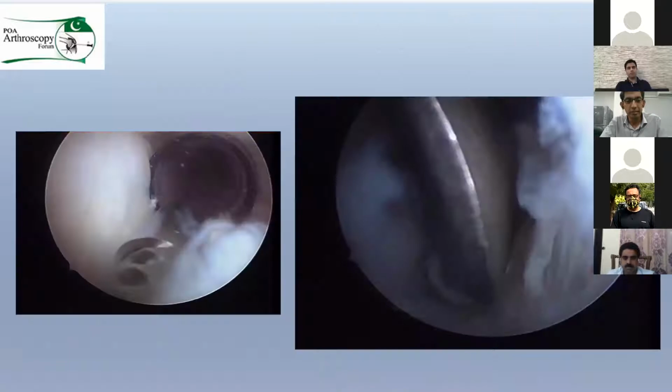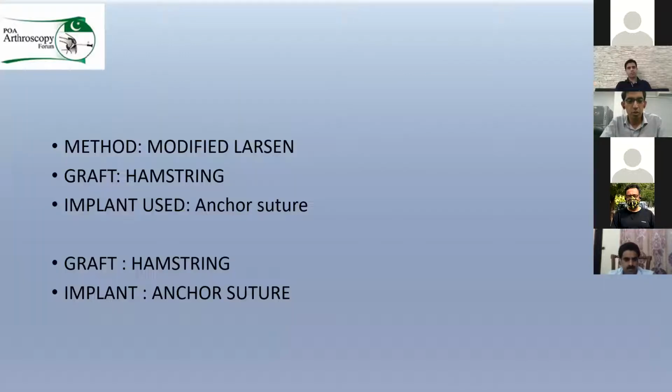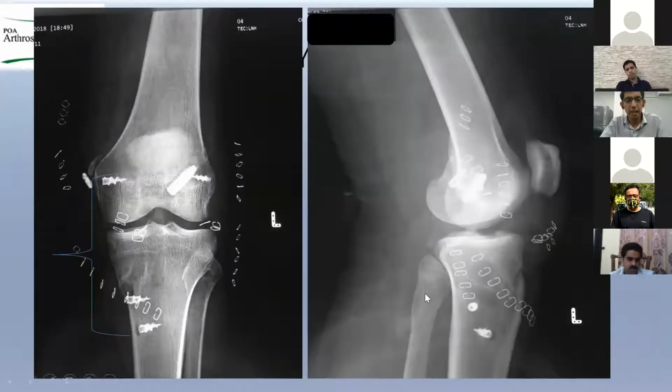We started with the PCL, reconstructed the PCL first. Then we did the ACL with the quad tendon. Then we went on to do our collaterals. So we did a modified Larson approach because of the limitation of the tendon to do your PLC. Plus we did an MCL reconstruction with the remaining hamstring graft to give them the normal structure. So this is the endobutton for PCL. This goes for MCL, the posterior oblique ligament, the middle structure, the ACL, and this is the PLC for the Larson loop technique that we used.